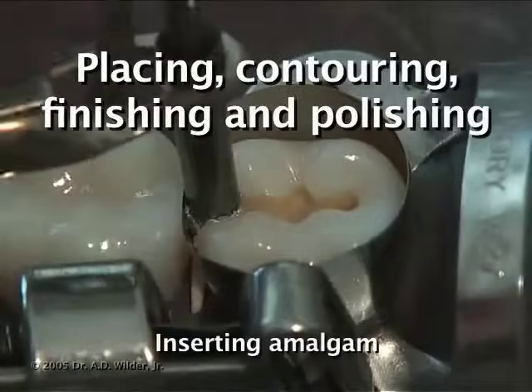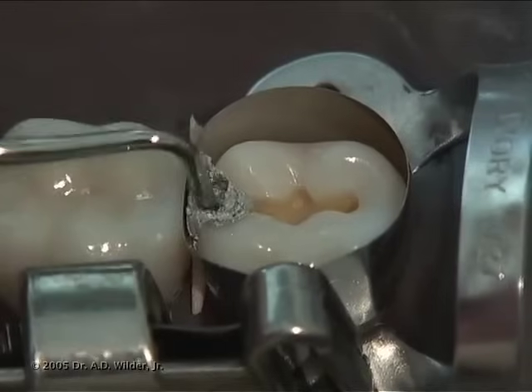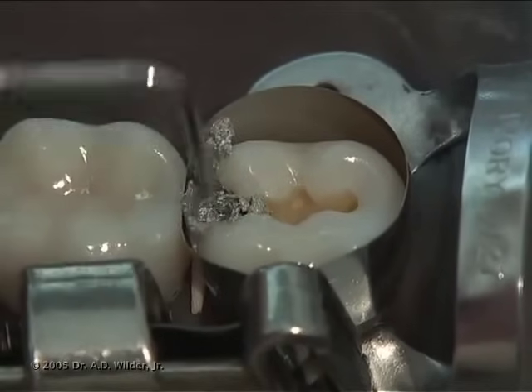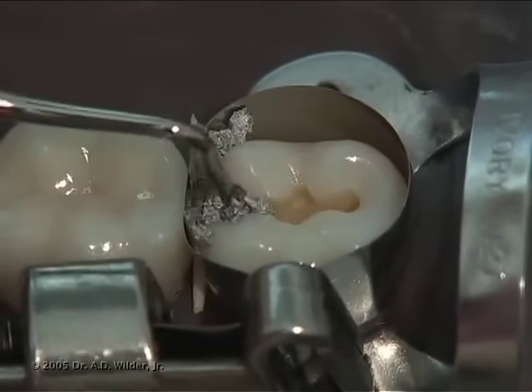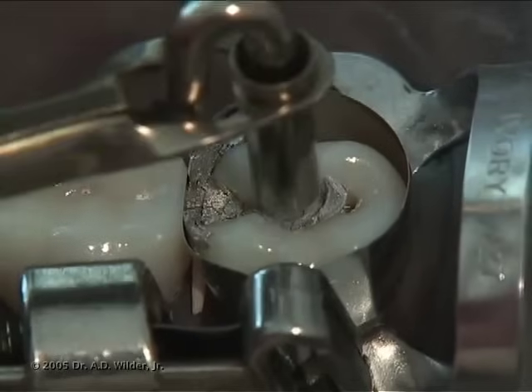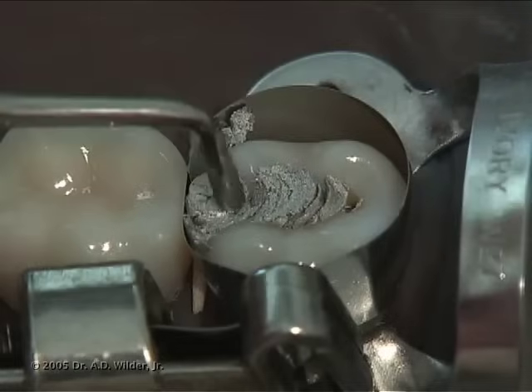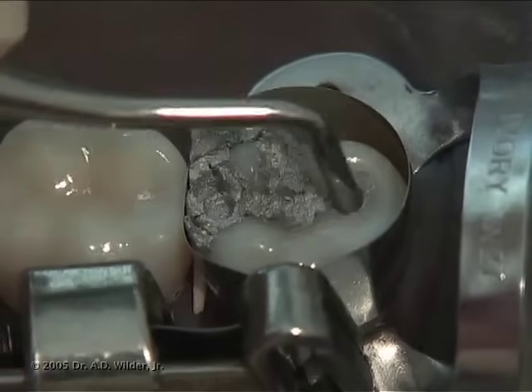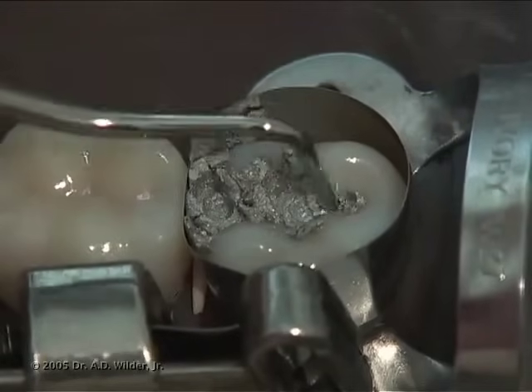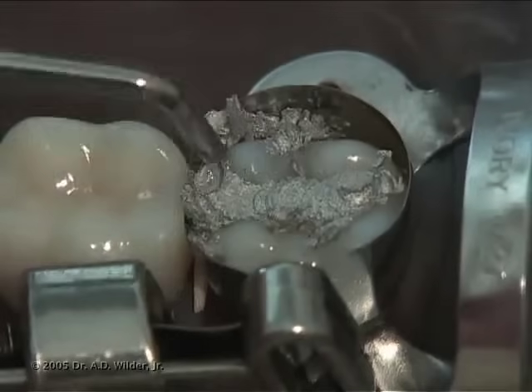After loading a triturated mix of amalgam into the amalgam carrier, insert it into the base of your proximal box and occlusal step. With the small end of the condenser first, compact the pliable mass of amalgam against the internal line angles of the preparation. Place new amalgam as needed and condense firmly and thoroughly to ensure that no voids are present. Be especially sure to condense the amount of amalgam in place.